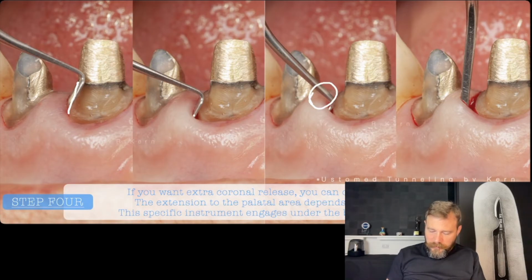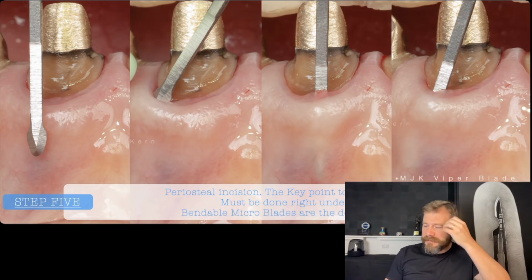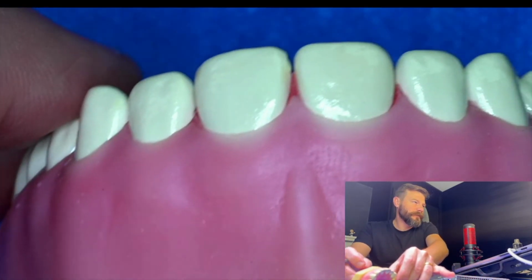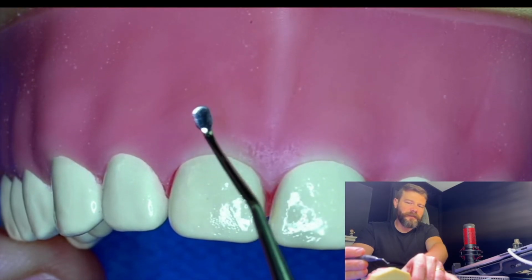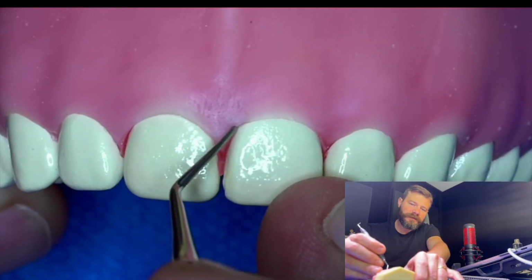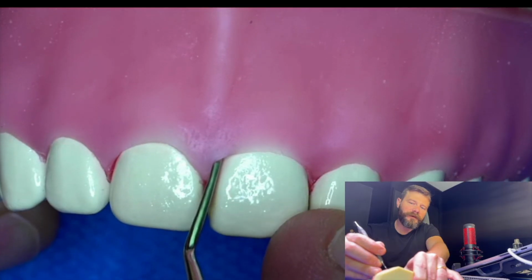Okay, so doing this step, let's just move one more slide here. All the tissue is free for me to start with the blade. Let me just bring once more the macro view here. Why is that? Because I want to show this instrument more closely. Okay, so let's bring once more the macro model here. Okay, proper direction. So one side was the one that I showed you. You see here the shape. We're going to bring it inside the sulcular area, and we rotate these instruments to go on the interproximal side, lifting the papilla on the interproximal side.